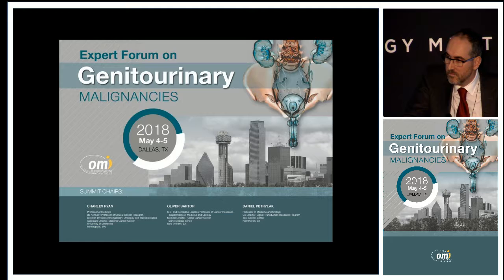And we are labeling with zirconium-89. The problem with the whole antibody is that if you image right away, you're just going to detect blood everywhere, and as you saw, there was a fair amount of background. But because we are using a tracer that has a very long half-life, we can wait and image later and hopefully reduce the background and be able to pick up the signal.